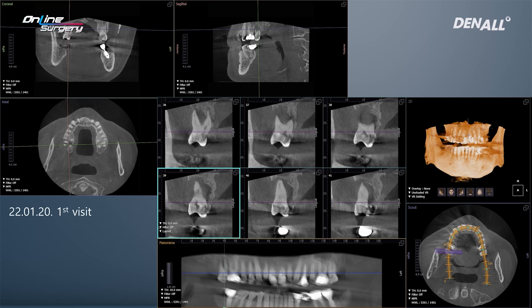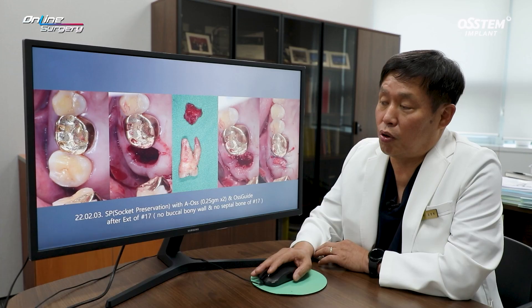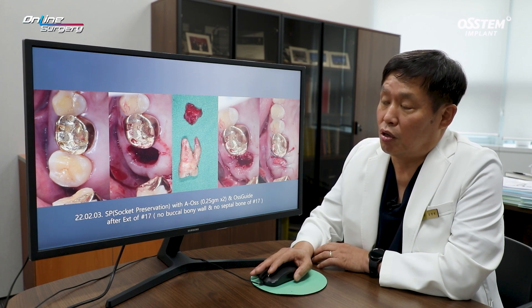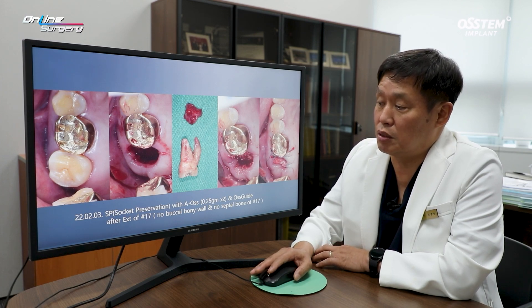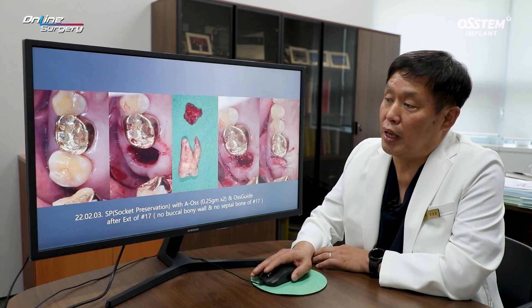The entire buccal bony wall was gone and significant alveolar bone destruction was observed. At the time of extraction, after removing number 17 and the granulation tissue, there was no wall whatsoever on the buccal side, and the septal bone between roots was gone as well. Socket preservation was done using AOS particle bone, and OS-guide was used on top.